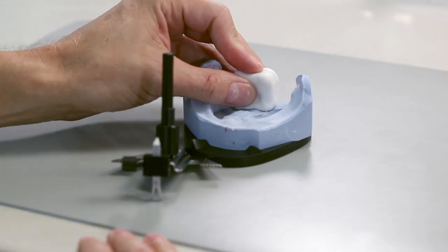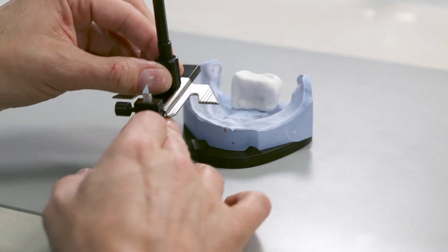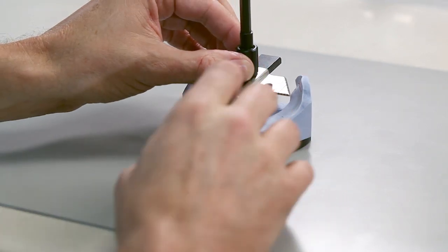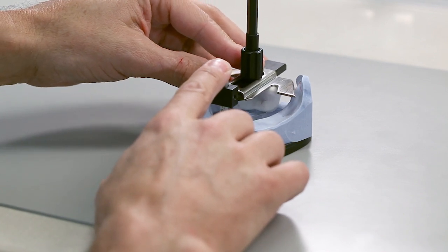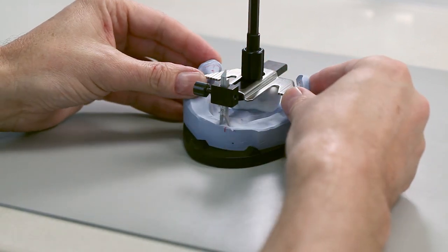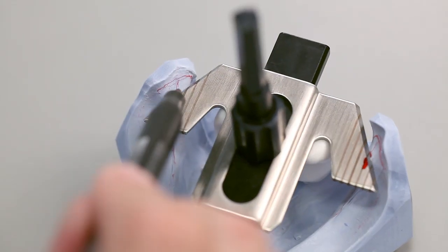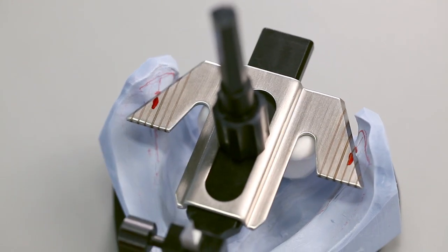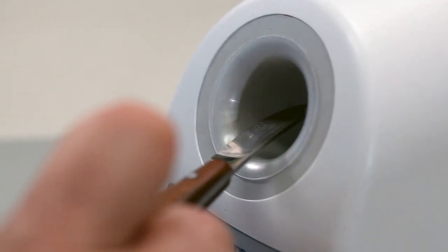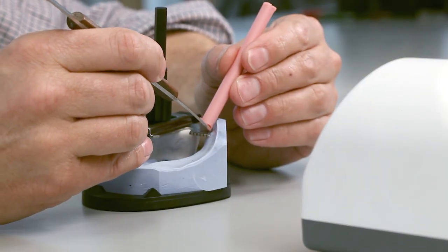The fork sits on the lowest point of the mucolabial fold, oriented according to the midline. Align the side wings towards the dorsal region to half of the retromolar pad. Adjust the wings of the horizontal guide according to the length of the mandible in a sagittal direction. Symmetrically align the line system with the alveolar ridge. Once you have reached the correct position, secure the horizontal guide on the model using sticky wax.